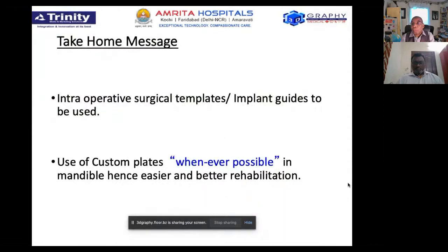So the take-home message would be, whenever possible, you should use intraoperative surgical stents or guides so that your procedure is more accurate and predictable, so that you don't have any confusion during the procedure. And I would suggest that, as far as possible, you should use custom plates, because one, it gives you a better outcome in terms of aesthetics and function. At the same time, your plate positioning is also much better.